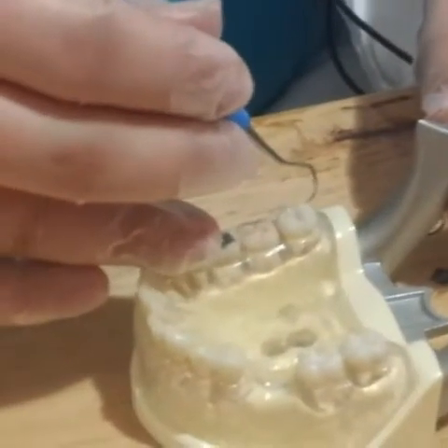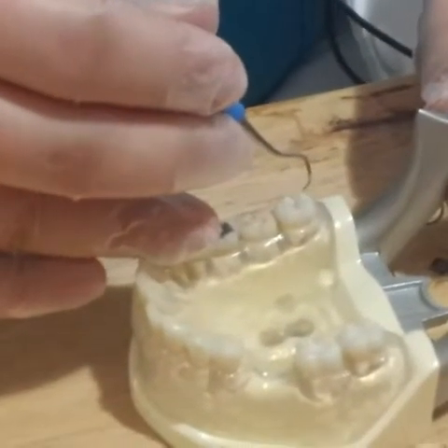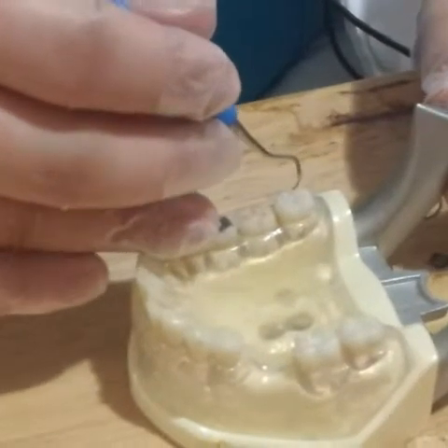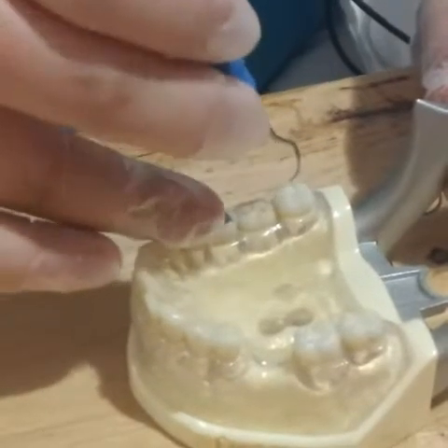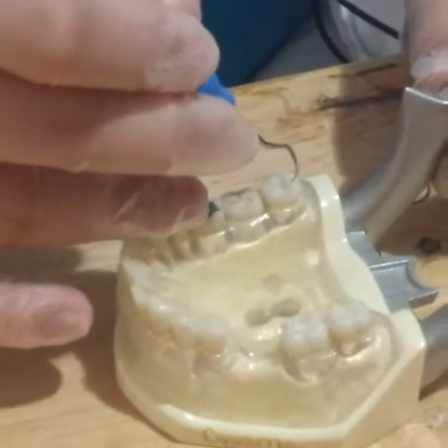Now you are ready to move to the lingual surfaces of quadrant 4 using the same techniques and sequence you used for the buccal and facial surfaces of all lower teeth.